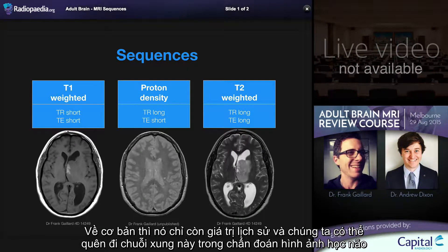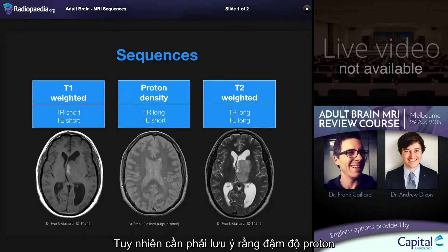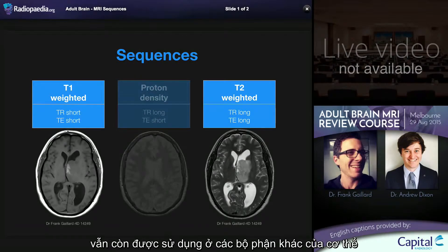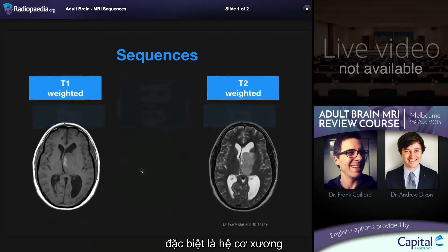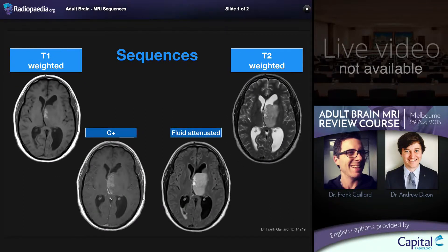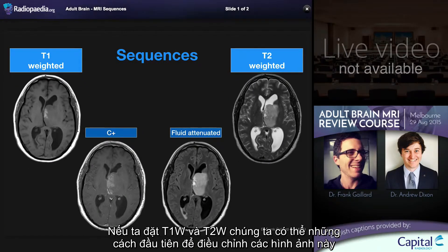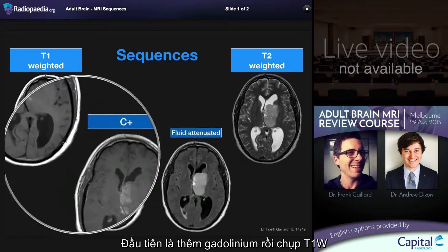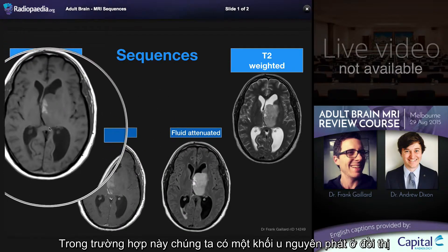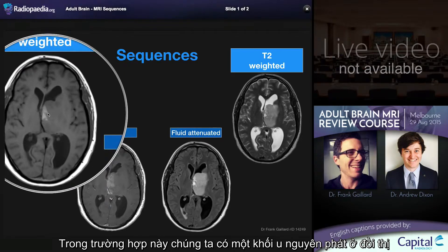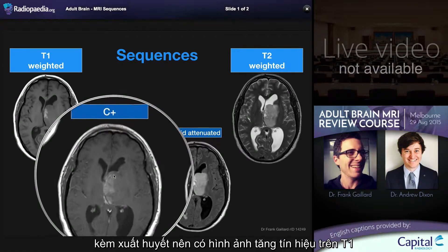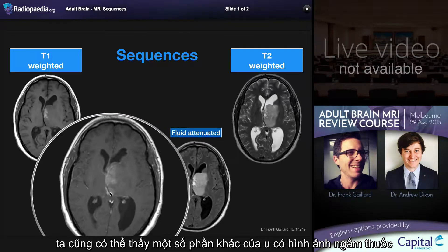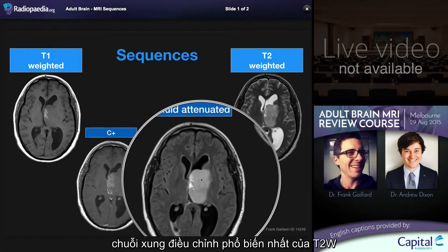Essentially we can consider proton density brain imaging as being only of historical value. It is important to note however that proton density as a sequence is still alive and well in other parts of the body, and is particularly useful in musculoskeletal imaging. Taking T1 and T2 weighted imaging, we can see the first ways that we can modify these images. The first is to add gadolinium and then perform T1 weighted sequences. In this case we have a thalamic primary brain tumor with some hemorrhagic change, which has intrinsic high T1 signal, and we can see that another component of it demonstrates contrast enhancement.